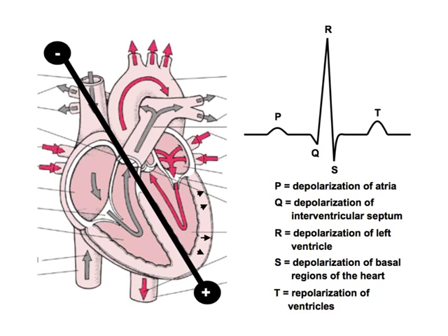We have the P wave, which is depolarization of the atria. We can understand how and why that would occur. It's proximal, it's an early part of the cardiac cycle. There's a bit of a gap between the pumping or the contraction of the atria and the ventricles, just to make sure there's enough filling time. The ventricle contraction is the QRS complex. We think about it together because often it's hard to separate, but here you have an attempt to separate the different components of the QRS complex.